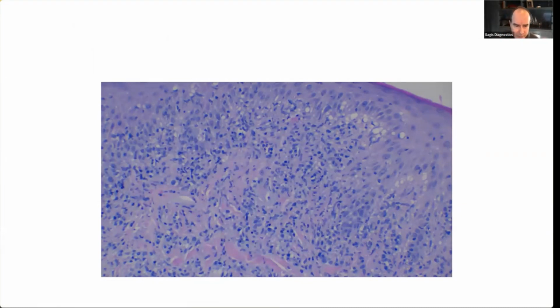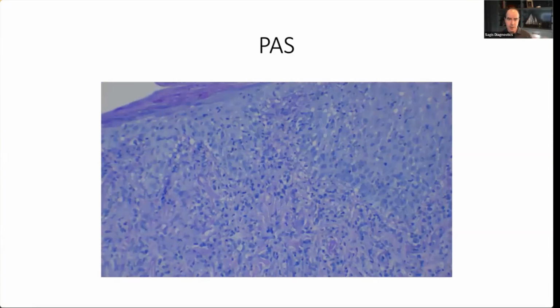So because we have a few plasma cells here, actually this is probably a plasma cell. Oh, here's a good plasma cell right here. Here's the perinuclear hof. With epidermotropic stuff going on and a little bit of pallor up here and some neutrophils, you've got to be thinking about syphilis here. And so what can we do? Well, let's throw on our PAS, make sure it's not fungus.